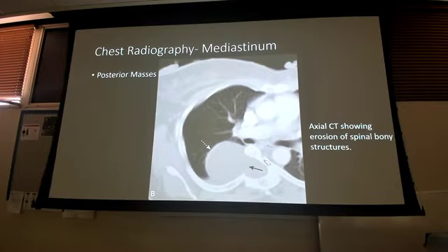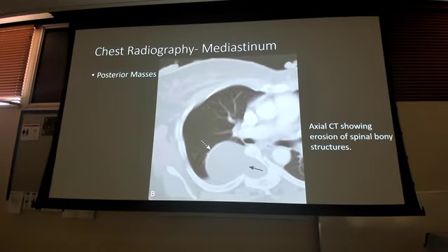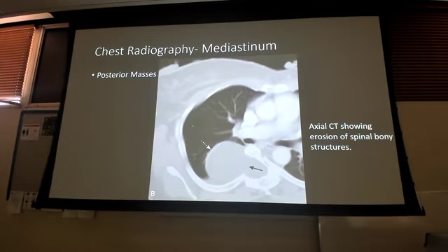But if I had one just sitting like on my rib here, that's gonna be more noticeable if the rib is missing, just the way the x-ray works. Because again, in the center, we have all this stuff, right? That's kind of hard to make out that the inside of my vertebral body is being eaten away by a potential lytic cancer. But ultimately, what you need to know is if you see this, you're going to get a CT to find out if this is what's going on or not, and to further evaluate. You'll get more in oncology, more in neurology about some of these kinds of things.